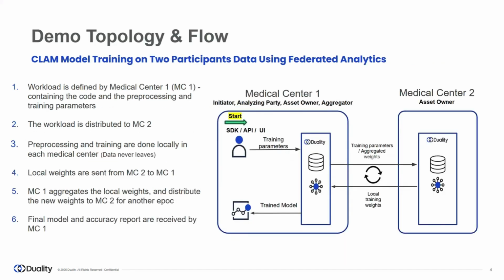In this demo, we will train a CLAM model using our federated learning platform. The dataset comes from two participating medical centers. The first medical center defines the workload, including the code and pre-processing steps required for training. This workload is then distributed to the second medical center.